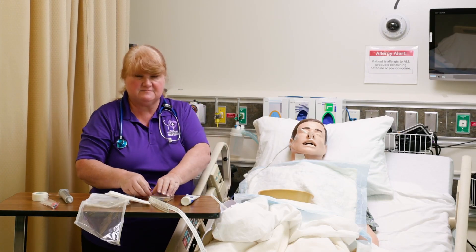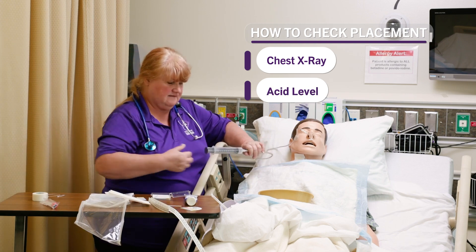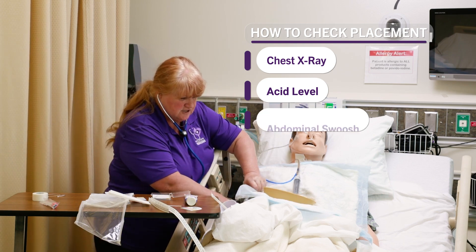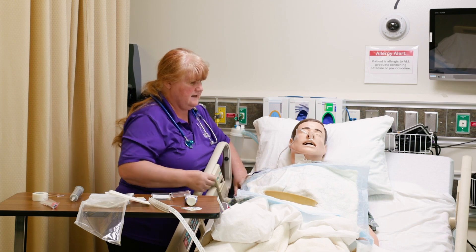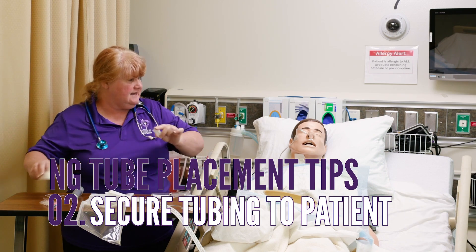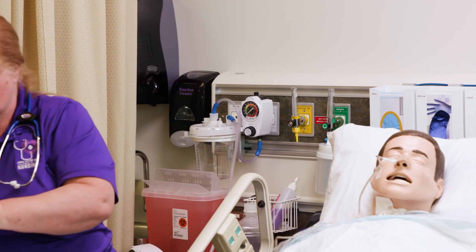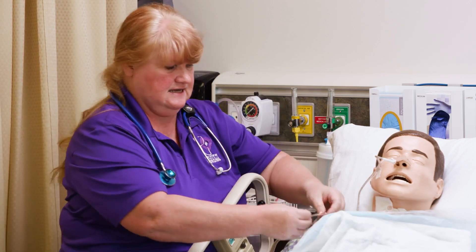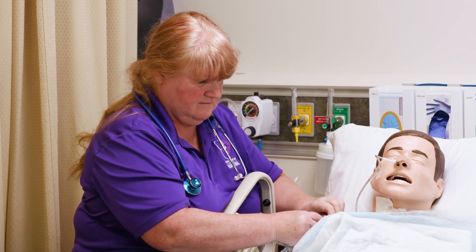There are different ways to check placement. The most preferred is the chest X-ray. Then you can check for gastric contents. The other way is to check for a swoosh — an abdominal swoosh — but that is the most unreliable method. We're going to hook it up, and before we put it to suction, we want to secure the tube to the patient using the device on their nose, and then hook it to the gown using the elastic wrapped around the tube and a safety pin so it doesn't get pulled.